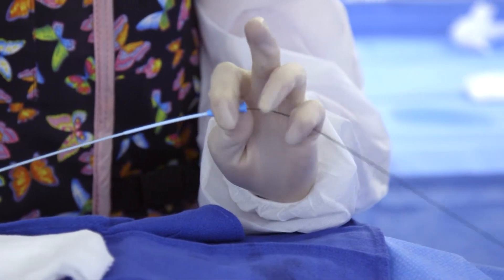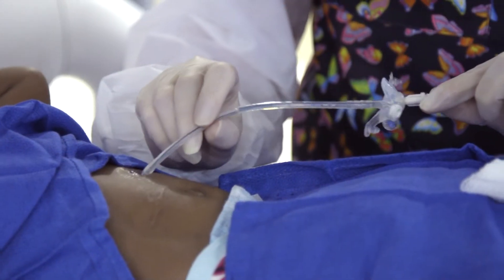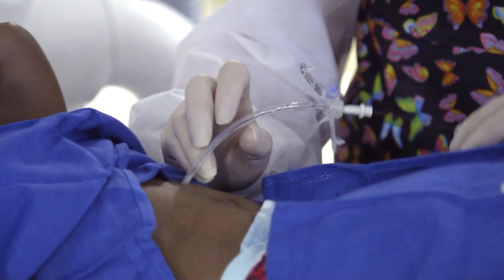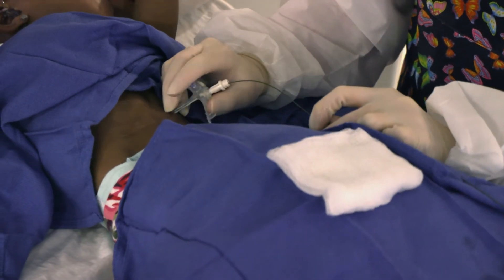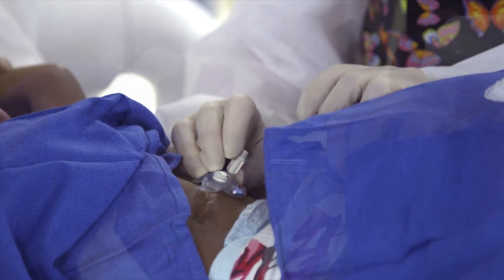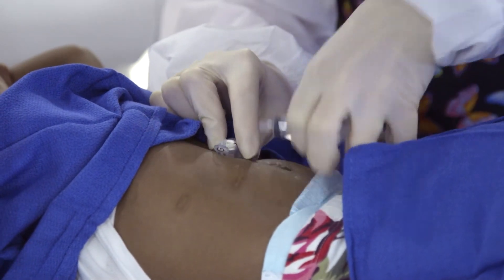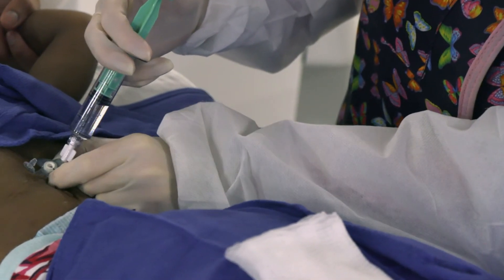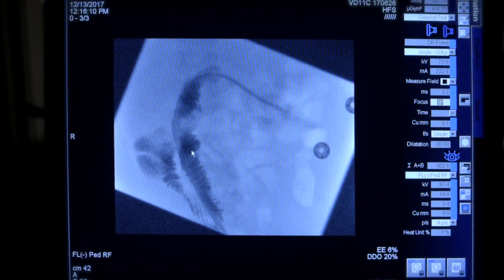After I get the guide wire in the right place, I can remove that catheter over the guide wire and, with the guide wire in place, I can advance the gastrojejunostomy tube over the guide wire to position it into the proximal small bowel. Then I'll inflate the balloon, and finally I'll inject contrast through the jejunostomy port to confirm appropriate position in the proximal jejunum.